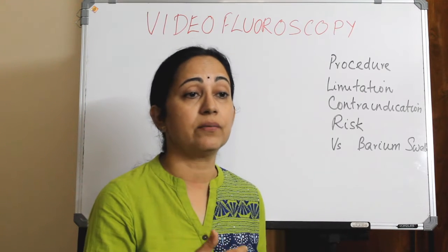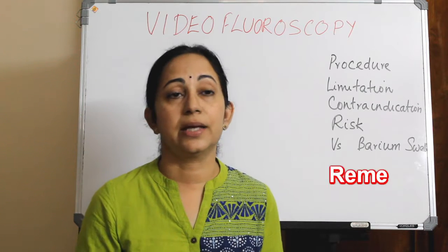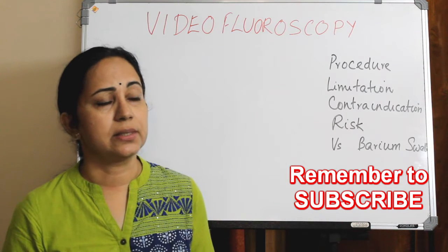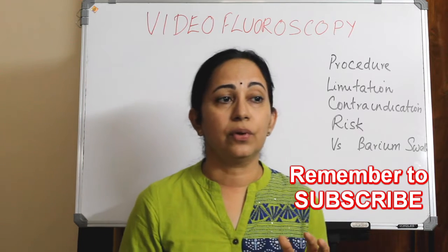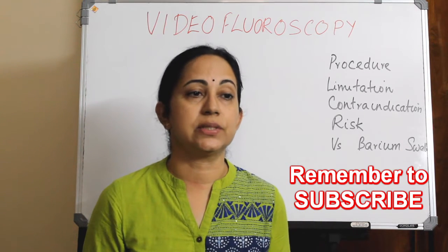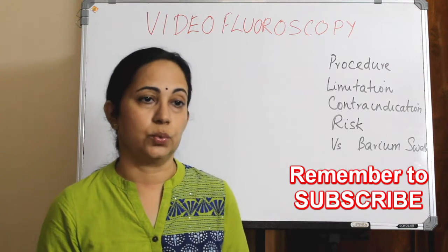So it is actually working as a biofeedback technique. As a patient can see the fluoroscopic images, the maneuvers needed for correction of dysphagia as a part of rehabilitation can also be done by doing a videofluoroscopy.